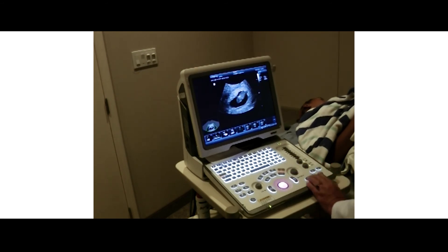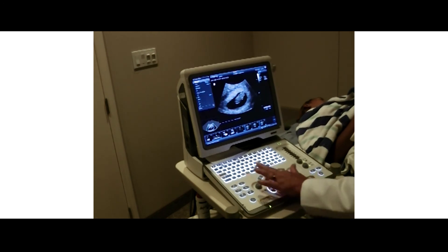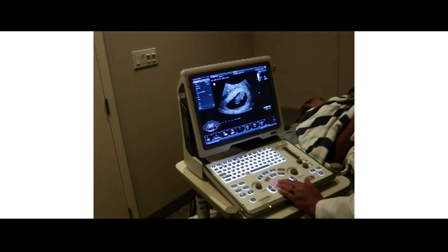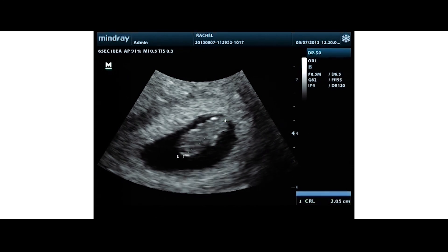I'm going to hit zoom and get a crown-rump measurement. We measure from the top of the head to the rump — eight weeks five days. Somewhere right in line.